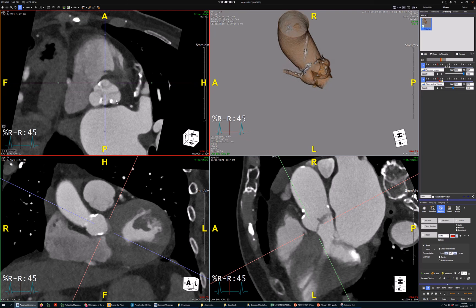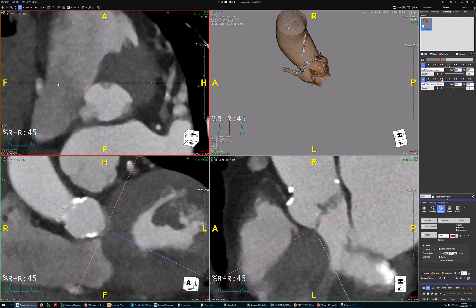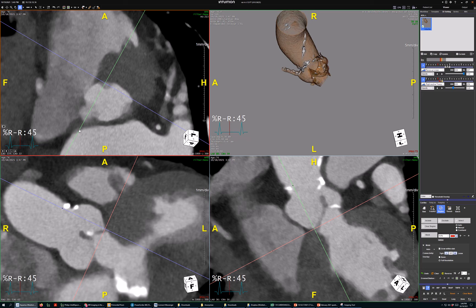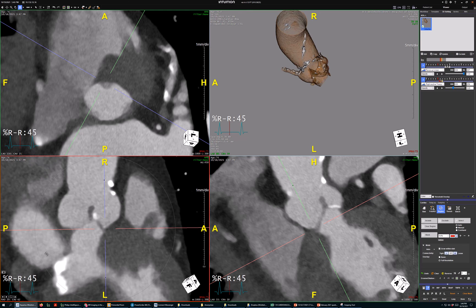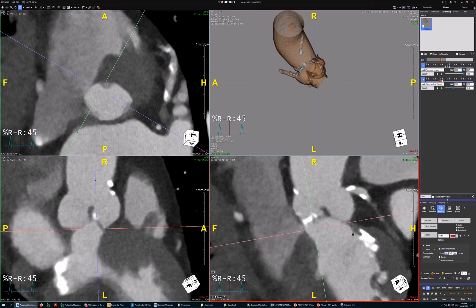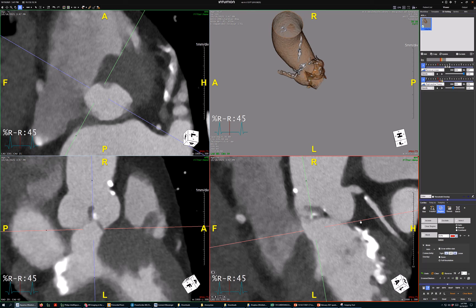Back to localizing the plane. Hold down the ALT key and click here on the right cusp — bring it up. Down here is the hinge point, the nature of the attachment of the leaflet of the valve. While looking in the axial plane, left mouse hold, grab the little circle and rotate it until the non-coronary sinus comes into view in the lower left panel. When it's at its lowest point, adjust the plane. I'm going to rotate the whole field of view. To confirm, we now have two hinge points — the right and the non. Confirm we're good for the left by holding down the middle and right mouse buttons together, translating back and forth until at the nadir of the left hinge point.